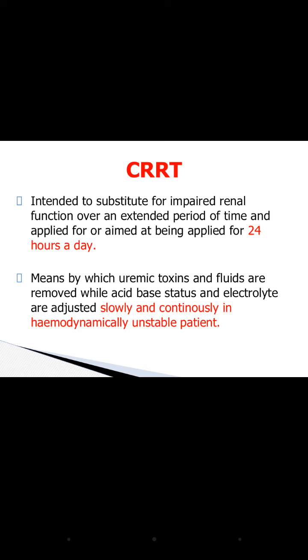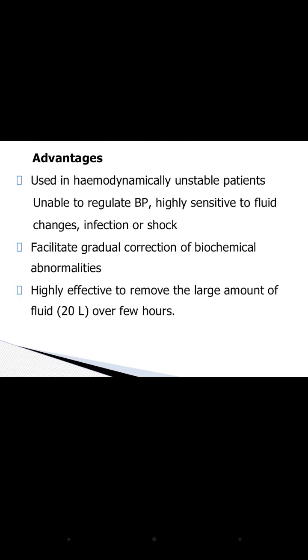So it is done very slowly and it is done 24 hours a day, so the chances of instability of the hemodynamic parameters reduces. That's why it is done 24 hours a day. Now, what are the advantages of this CRRT? Basically, it is used in hemodynamically unstable patients who are unable to regulate their blood pressure, who are highly sensitive to the fluid changes and weight gain, and who are highly sensitive to infection or shock.